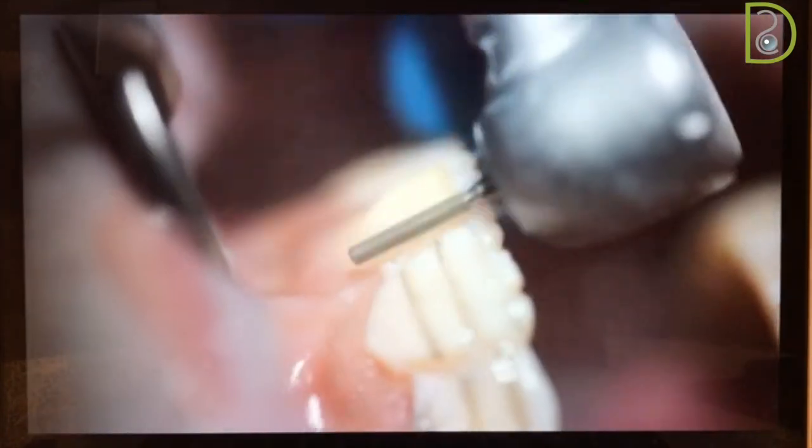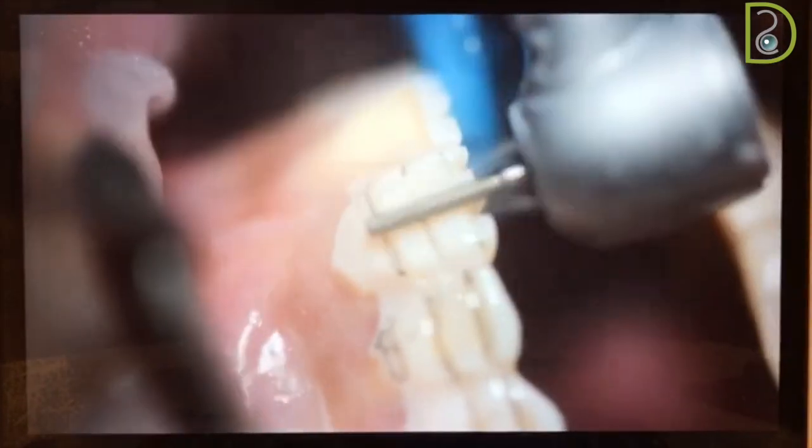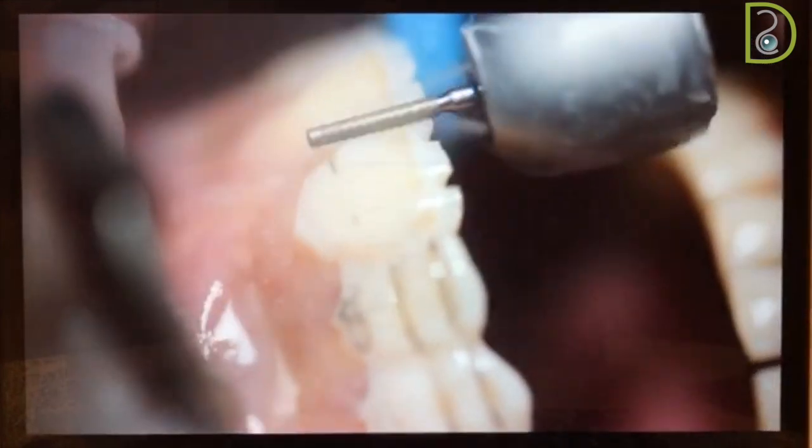grooves. Again, incisal reduction using diamond wheel reduction, about 1.5 to 2 millimeters, to make a butt joint preparation. Now this is, yes, one type of veneer preparation. After depth cutting, the 0.5, then you can continue, just to make it clear, till the marks completely disappear. Once the marks disappear, that will indicate that you reached the depth you're looking for. So now you need to stop your facial preparation.